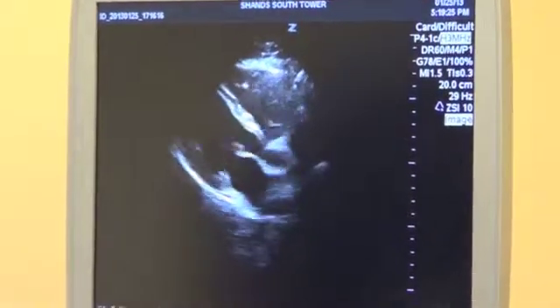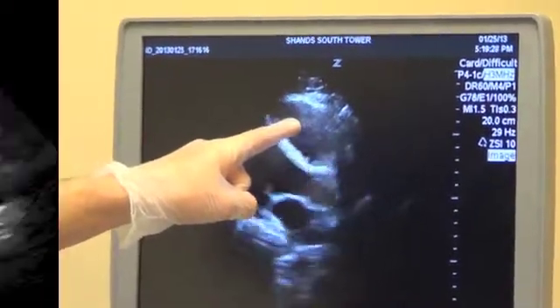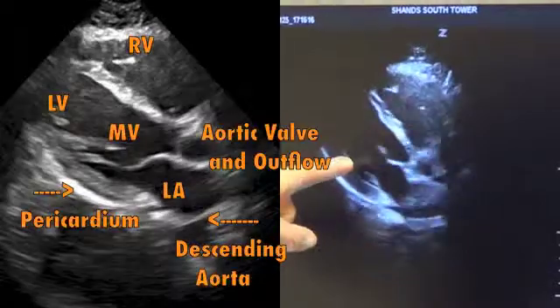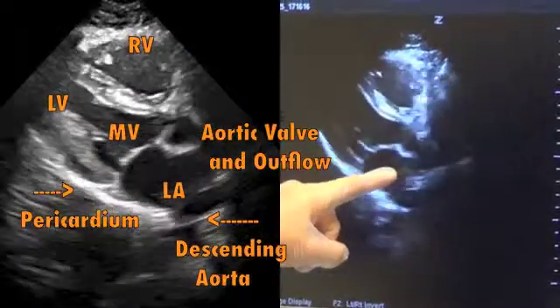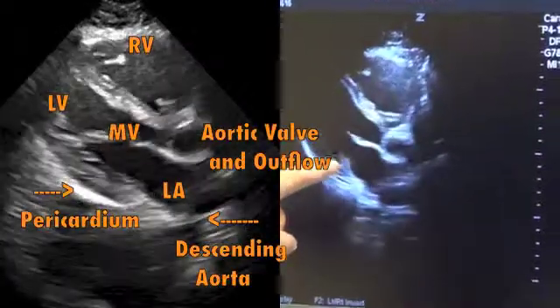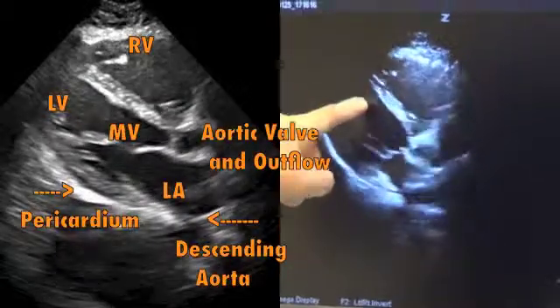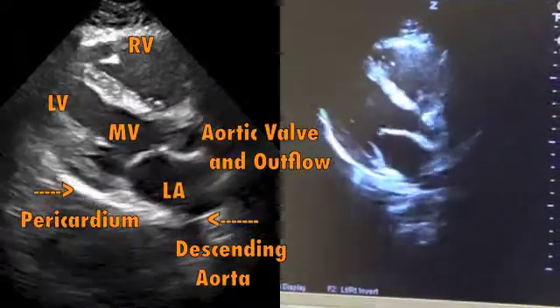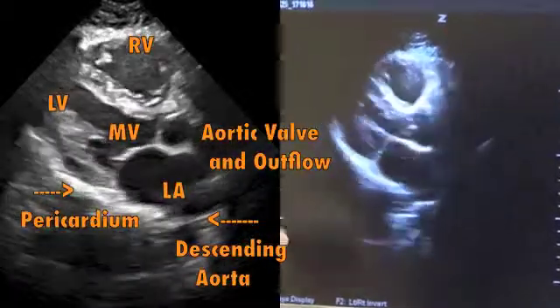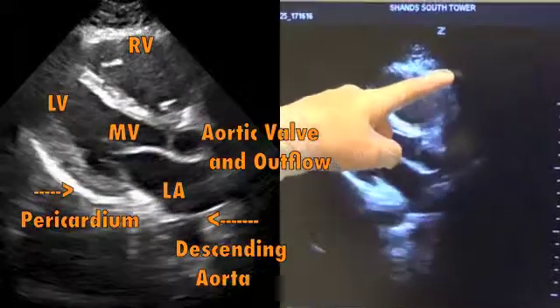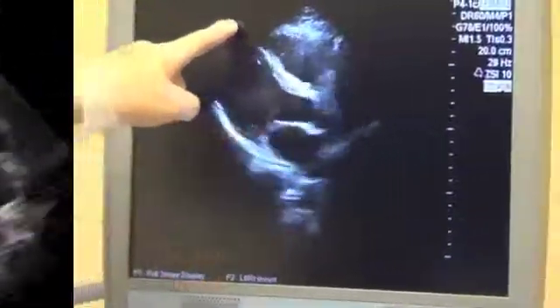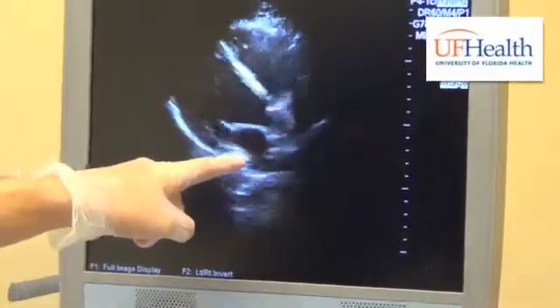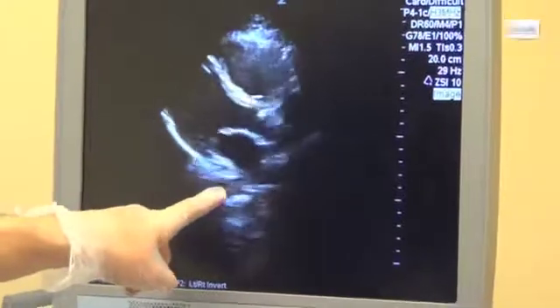A review of the anatomy shows the right ventricle most anterior, the left ventricle — the large muscular chamber — connecting of course to the left atrium via the mitral valve, as well as the aortic outflow tract to the aortic valve. The pericardial space is located here anteriorly, wraps around the apex, and again located here posteriorly, moving anteriorly to the descending aorta.